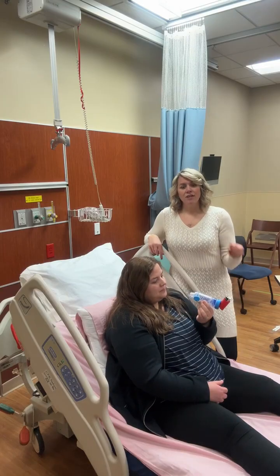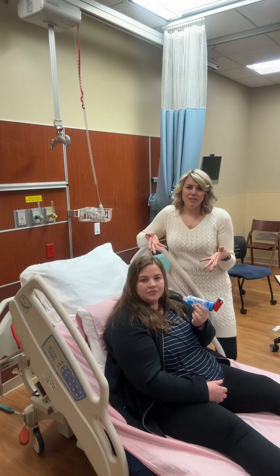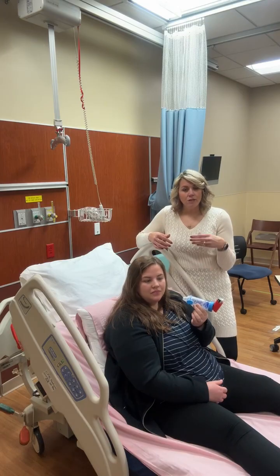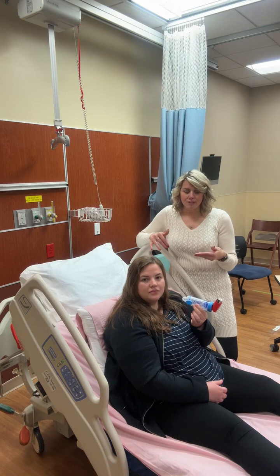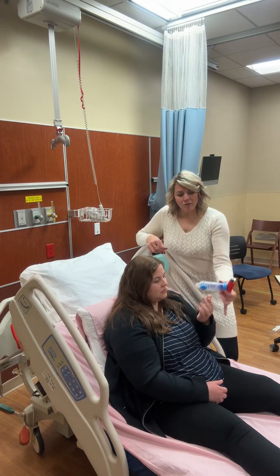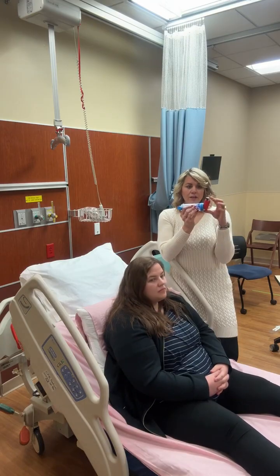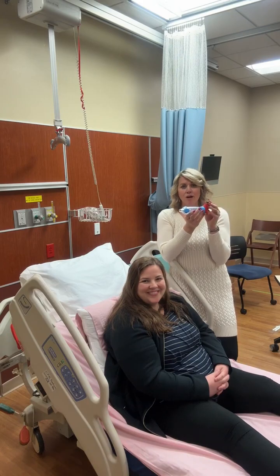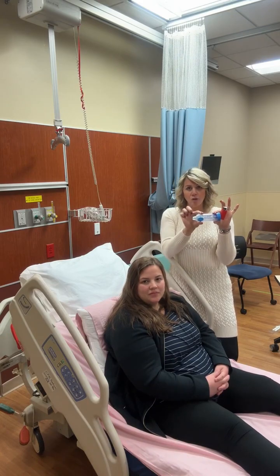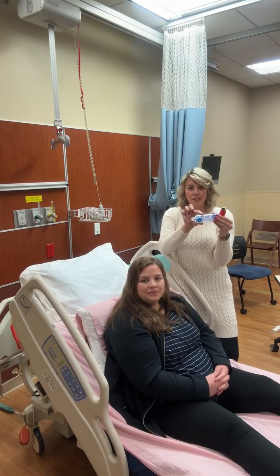So in that event, she's breathing too hard and too fast, and the medication is not going to be getting to her in a therapeutic way. If you hear that noise, you have to slow down your breathing so that you don't hear it. In this situation, we would push the button in here, and I'm not going to push it because this is albuterol. We would push the button down and the medication will go in the tube. Let's say I pushed it down and now there's medication in here.